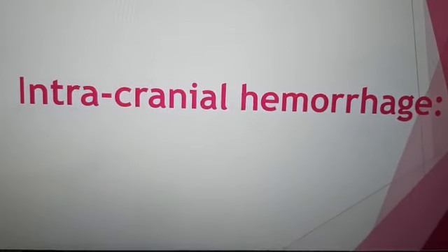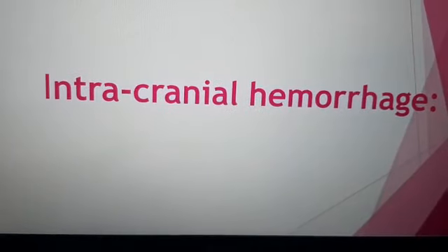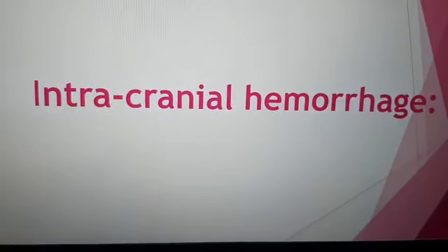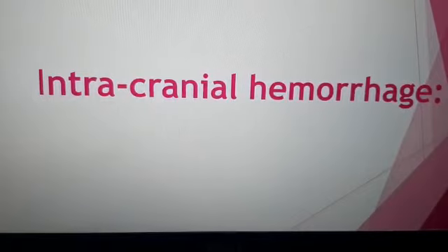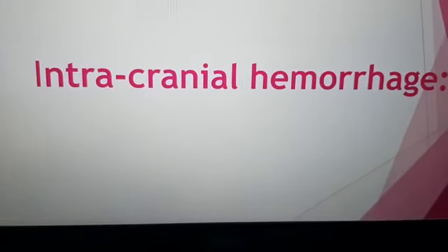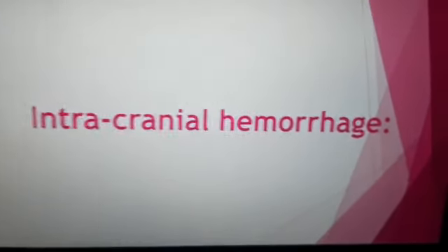Assalamu alaikum. Today our lecture will be about intracranial hemorrhage. Intracranial hemorrhage is one of the emergency subjects. In this lecture, we will learn how we can diagnose intracranial hemorrhage radiologically, how we can diagnose it, and what the types of intracranial hemorrhage are.